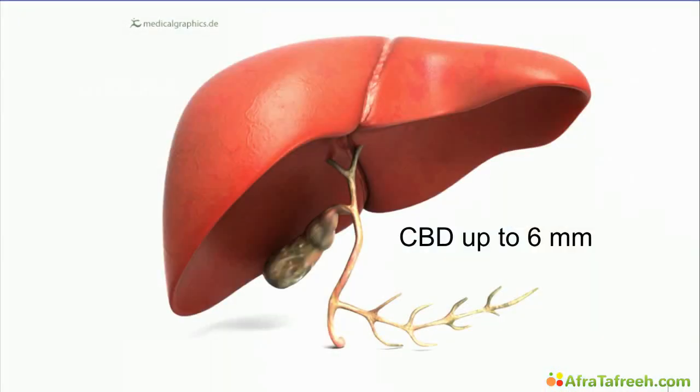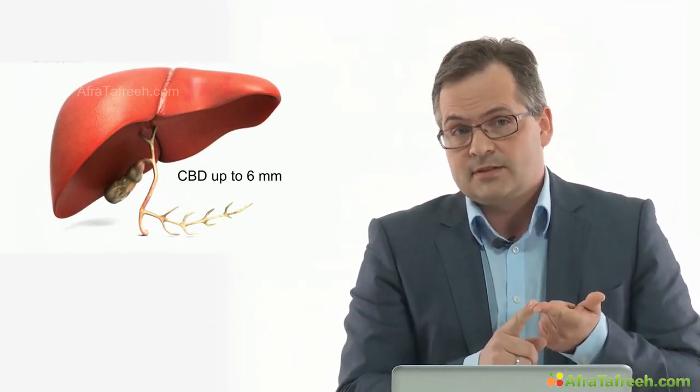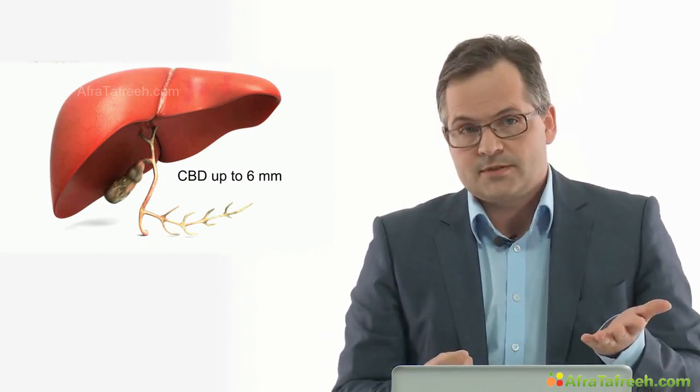This is very important. In the case of dilated bile ducts, it's absolutely essential to localize the pathology. We have to answer the following questions. Is the common bile duct dilated? Are the bile ducts in the liver dilated? Are there any gallstones? Is a gallstone visible in the common bile duct, or does a tumor exist?